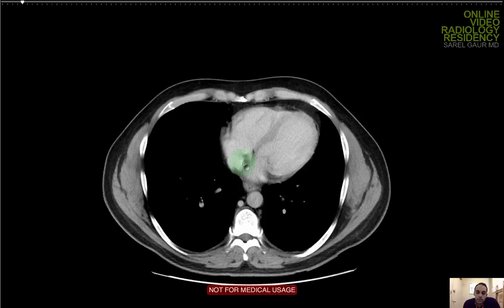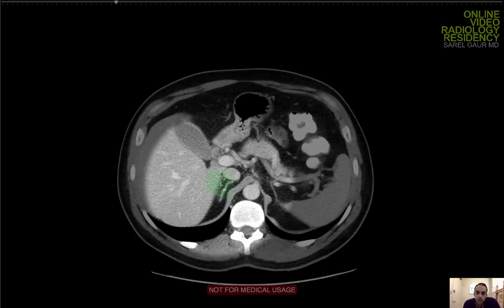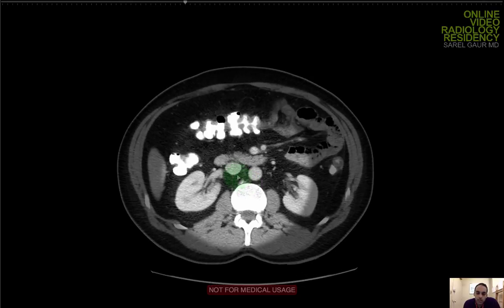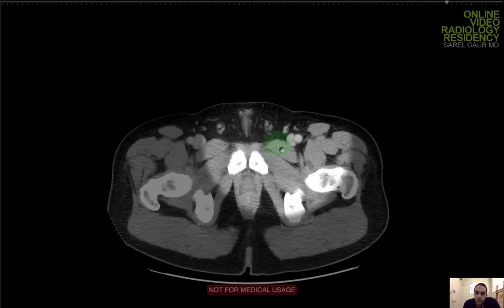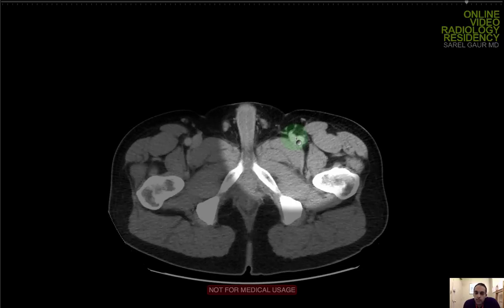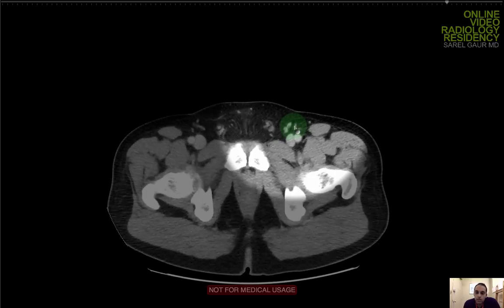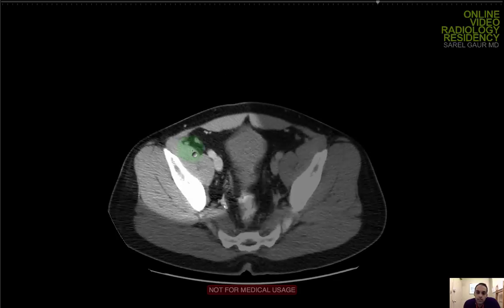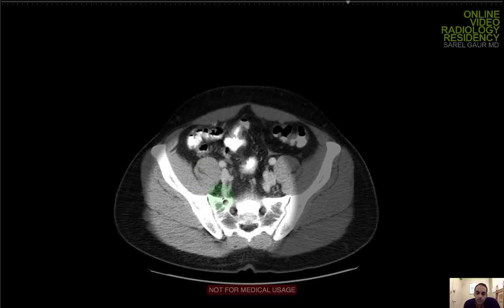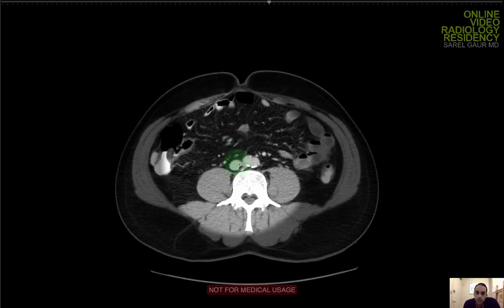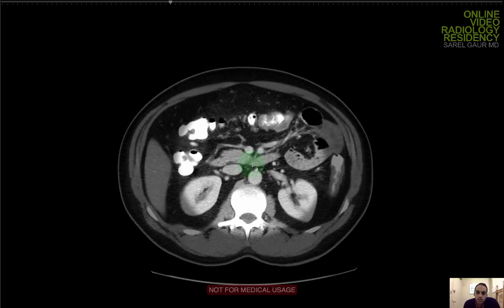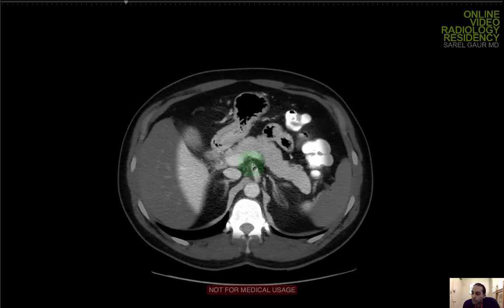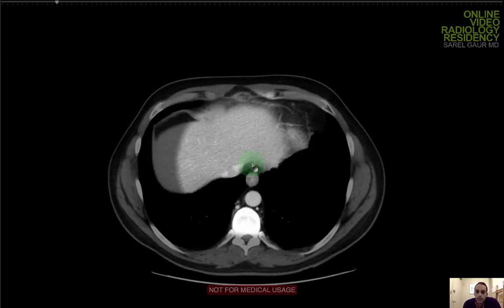Back to axials — now I'm looking for nodes. Running the retroperitoneum, looking for any enlarged nodes, one centimeter short axis or larger. I'm seeing a couple of inguinal nodes, which are normal. Running each external iliac and the internal iliacs, then looking in the mesentery again for any enlarged nodes greater than one centimeter in short axis diameter. I'm not seeing any adenopathy.